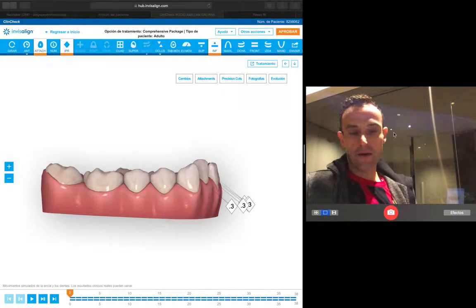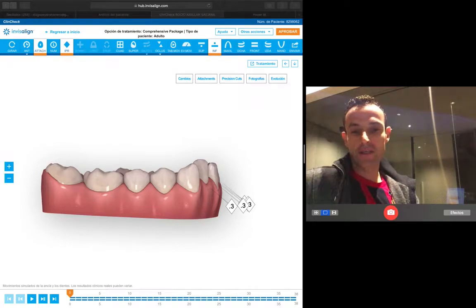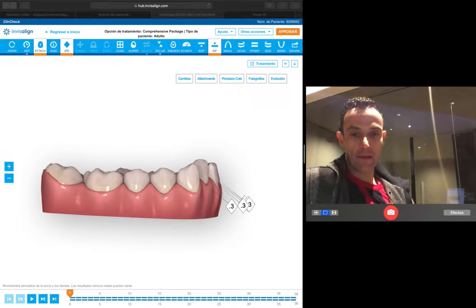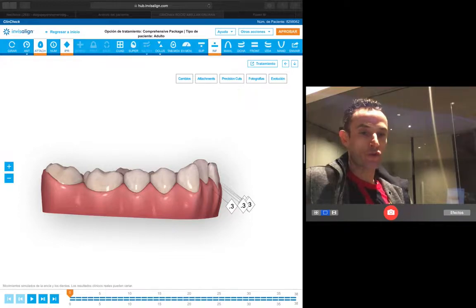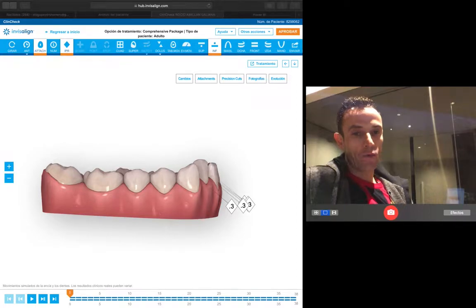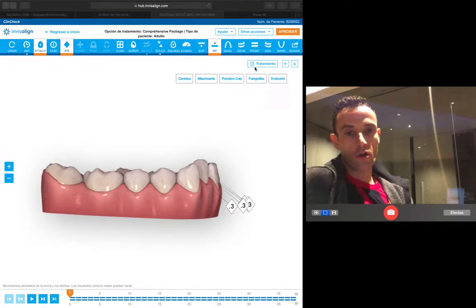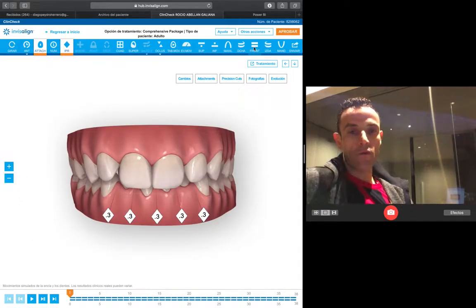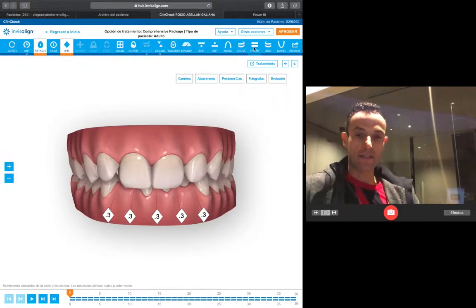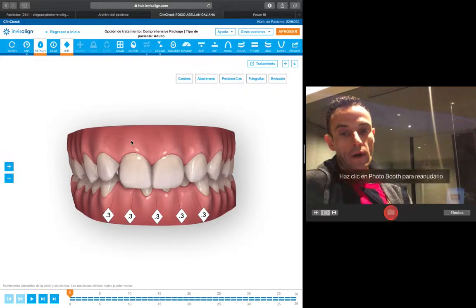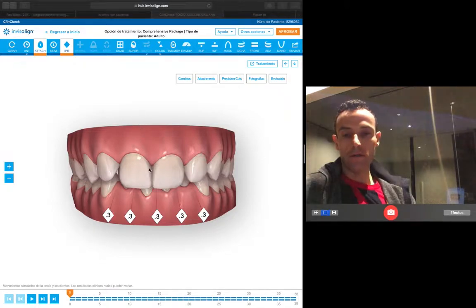Good morning everybody. I want to show you this short video about the way I plan the lower incisor intrusion when I want to reduce the Spee curve and improve and solve the deep bite that we find in some of our cases. Look at this case — you can see here we have a severe deep bite, and I want to plan the upper and lower intrusion.